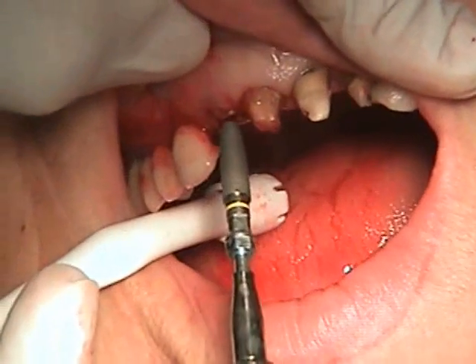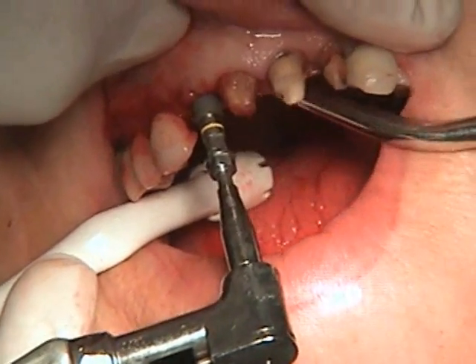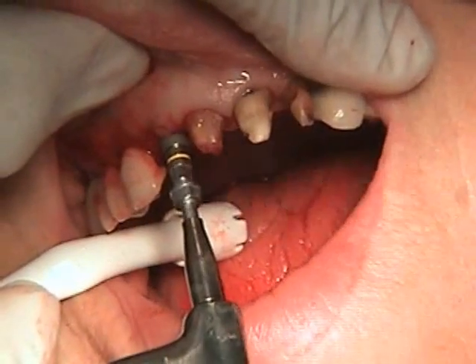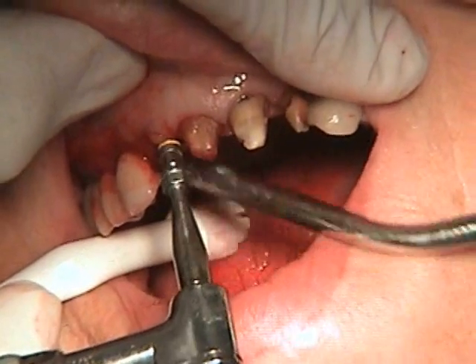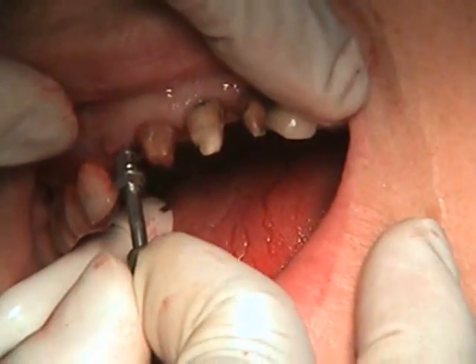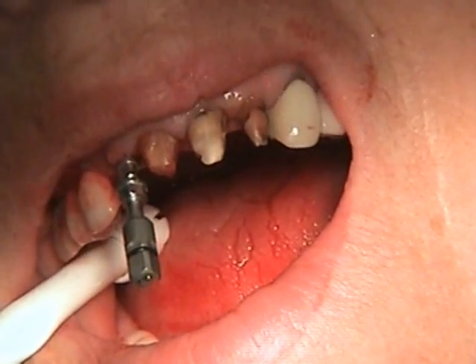We're going to go ahead now and place our Blue Sky Bio Trilobe Compatible Implant. It's prosthetically compatible with Nobel Replace and has very aggressive apical threads, so even though the bone is soft, it will lock in nicely. You'll see soon that the handpiece will stall. If you have a Nobel wrench, you can just put it on and continue driving it.